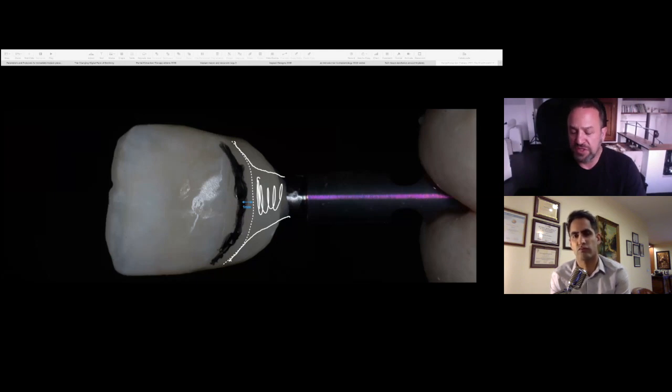A lot of people prefer to go for more customized healing abutments and emergence profiles. I don't find it necessary, but if that's what you do, I know Chuck Schwimmer from our group loves doing that kind of thing, and he does amazing work, and that's certainly something that can be done. But from my own experience, I don't personally do that. I only do that in the aesthetic zone.